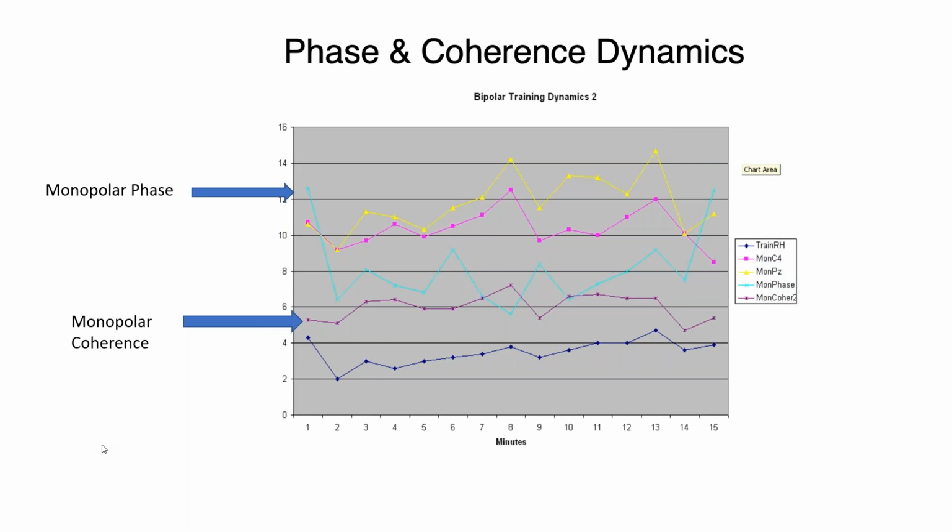We had all 3 Brainmaster amps going to each of those locations, and we had to be careful. We couldn't get precisely the same location because we had to avoid bridging there as well. We had to measure the scalp exactly. We were using calipers so that when we put the cap on, we weren't getting bridging between the cap and the other sensors. The cap was on the precise locations, but these sensors were slightly off the location, though within the range of the dipole output from the mid layers. We knew that we were getting mostly the same dipole groups.